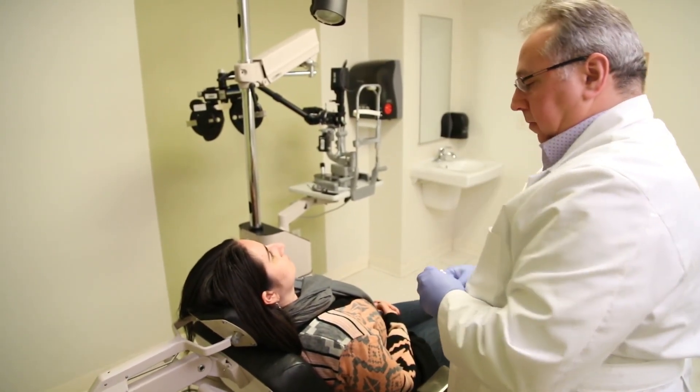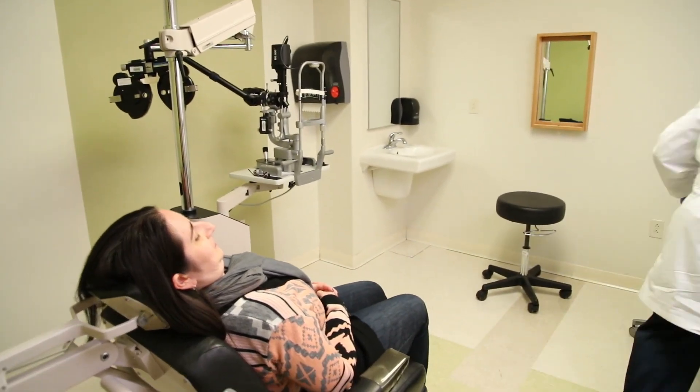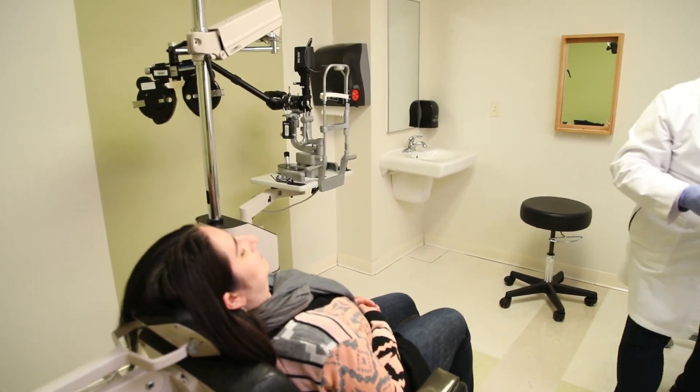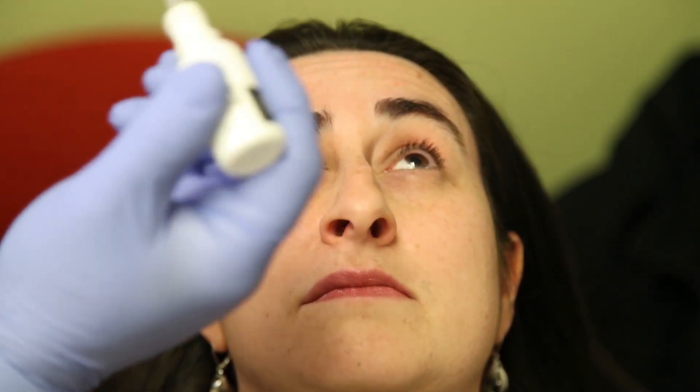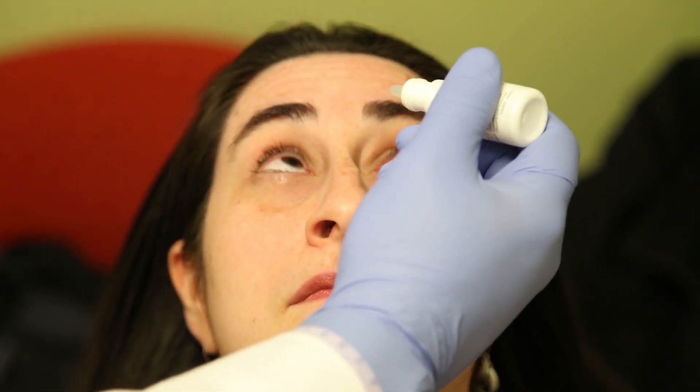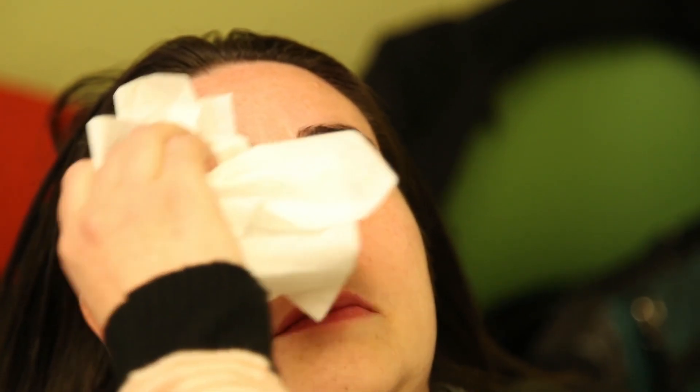Then prepare the patient by reclining the chair slightly. Make sure the doctor or technician is comfortable when performing the procedure. If you are performing the procedure from a seated position, it is best to lay the patient flat. Next, instill one drop of anesthetic into each eye.